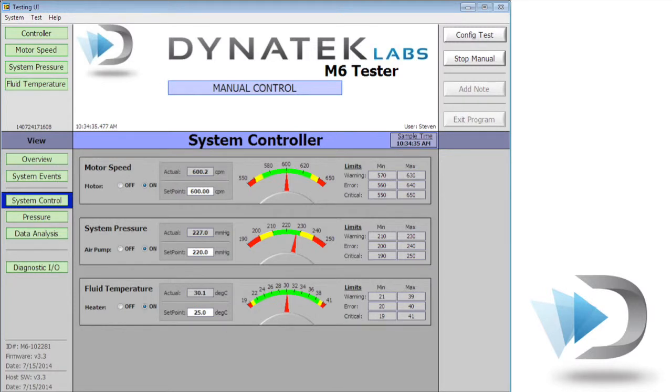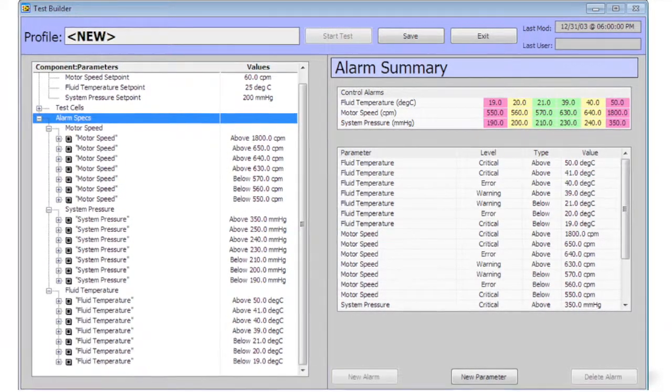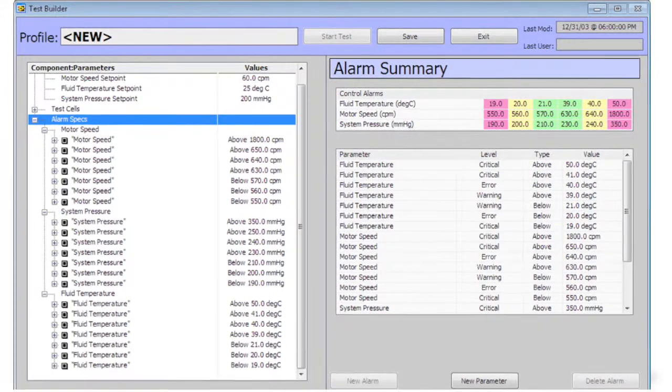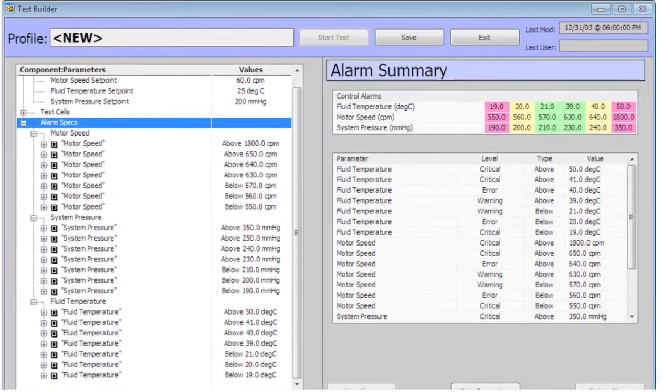All testing parameters are easily viewed and adjusted from pertinent working screens. Values associated with the test are saved as frequently as a user chooses, up to once a minute. All testing parameters are compared to user-chosen values and can halt a test if these are exceeded.